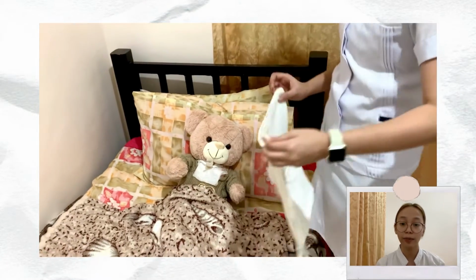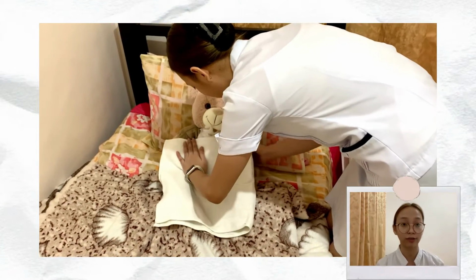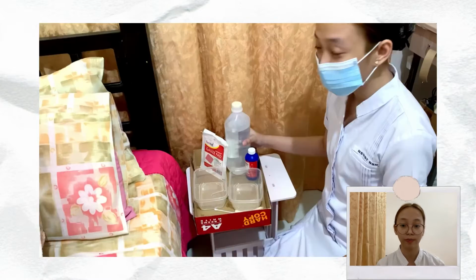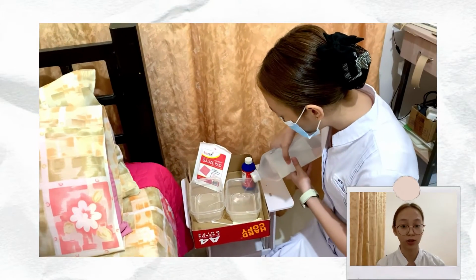Number 9, place the towel below the trachea site, covering the neck and chest of the client. Number 10, put on face shield or goggles and mask. Suction tracheostomy if necessary. If tracheostomy has been suctioned, remove soiled site dressing and discard before removal of gloves used to perform suctioning. Number 11, prepare the basins and cleaning solution.